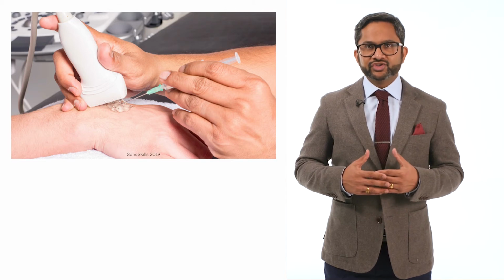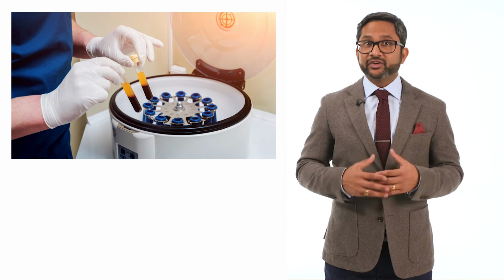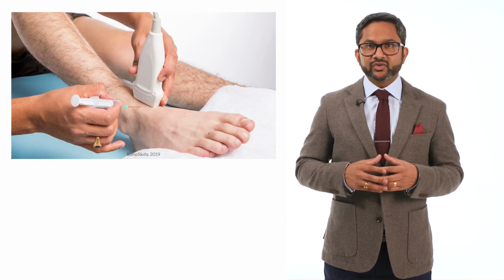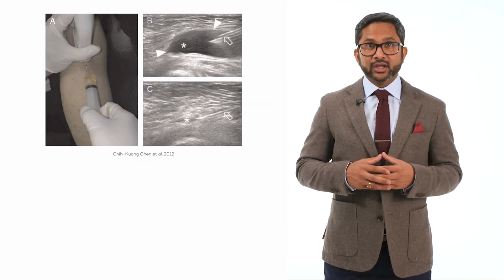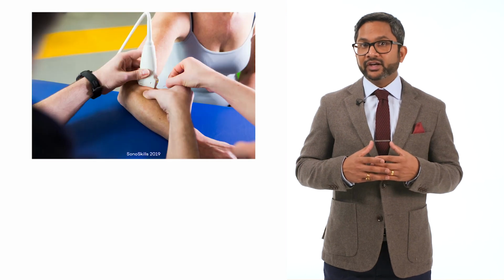Ultrasound guidance intervention is used in the administering of biologics such as platelet-rich plasma and stem cells. Ultrasound guidance is also used to perform prolotherapy. Furthermore, it can be used when performing the aspiration of fluids and the needling of tissues.